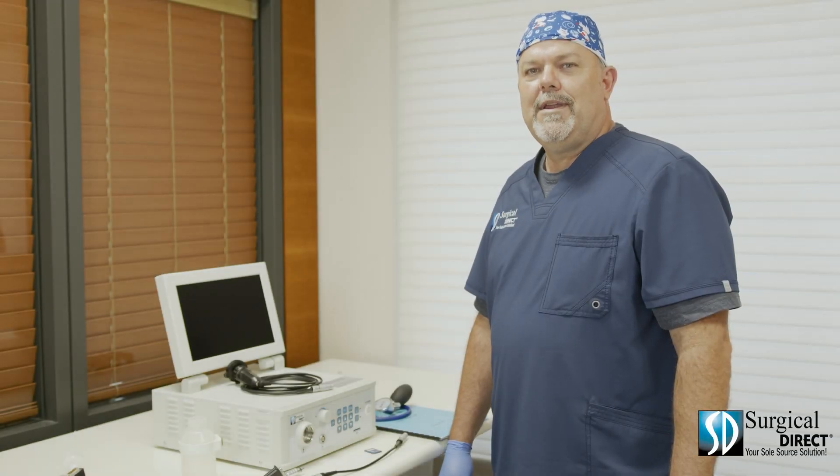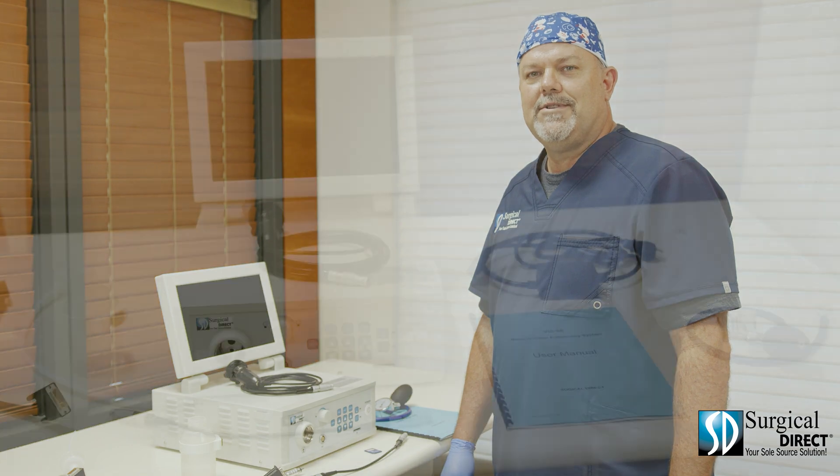Hi, I'm Joe, the Clinical Operations Manager with Surgical Direct. Today we're going to talk about the Veterinary Endoscopy System.